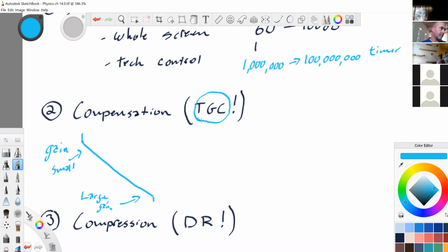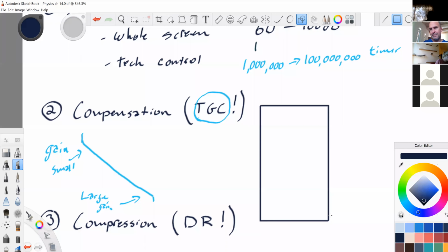Also in decibels. Yeah, so this is kind of a tricky concept. So let's think about this. Let me just draw this out again. I'll just draw an ultrasound image. Here it's a linear transducer, and we're going pretty deep. Let's just say we go to 10 centimeters here.